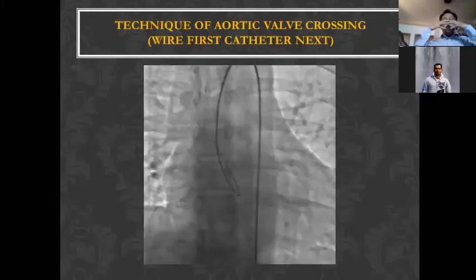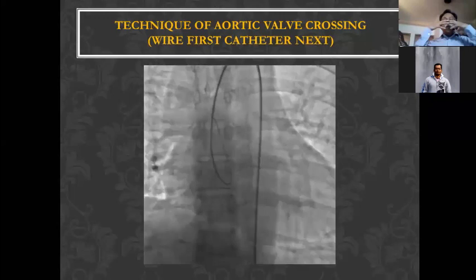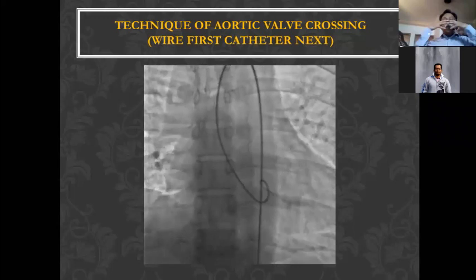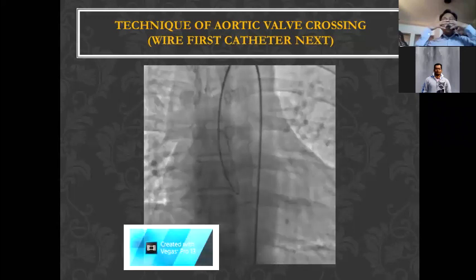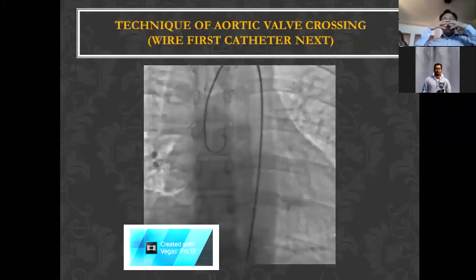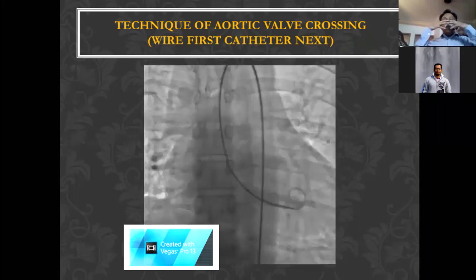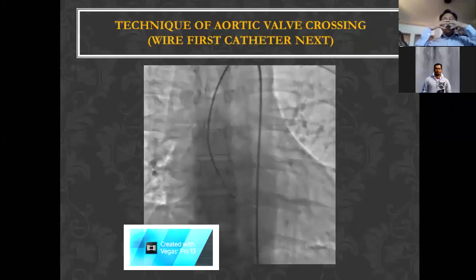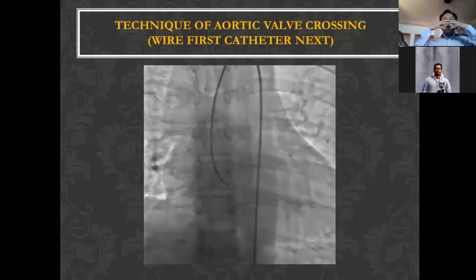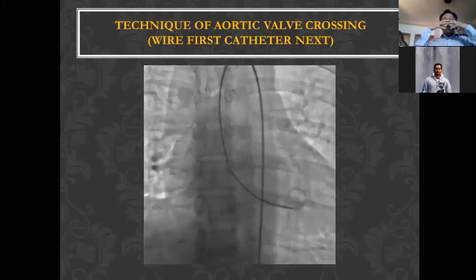One interesting segment, actually, I want to show to you: nowadays, we don't need to do LVgraphy, but LVgraphy also you need to know. There is a technique. Yes, your technician can do the procedure because all these are pre-shaped catheters, but the technician does it blindly, but you are doing it knowing the technique. So this is one of the techniques that you can use to avoid unnecessary manipulation of a catheter to enter the LV through the aortic valve, especially in a patient with a sclerotic aortic valve where there are difficulties.